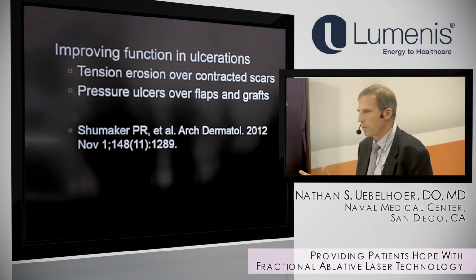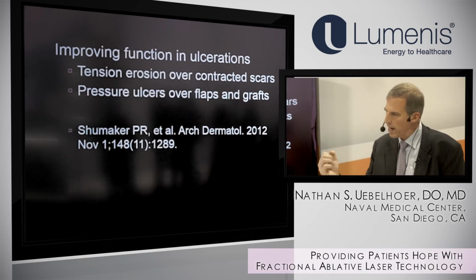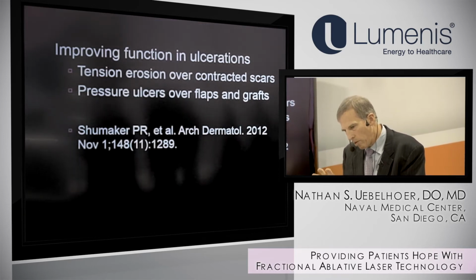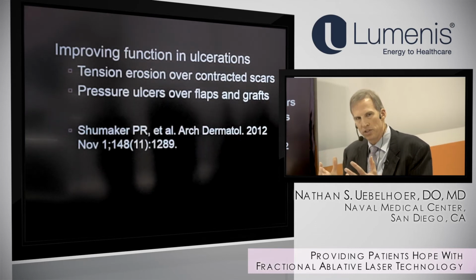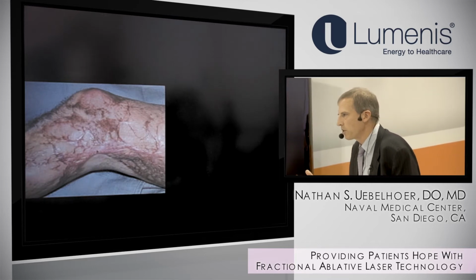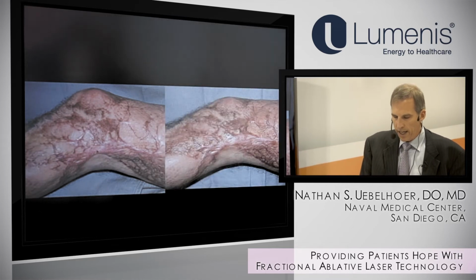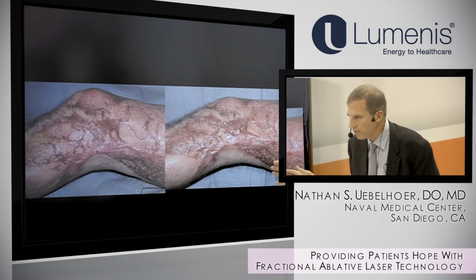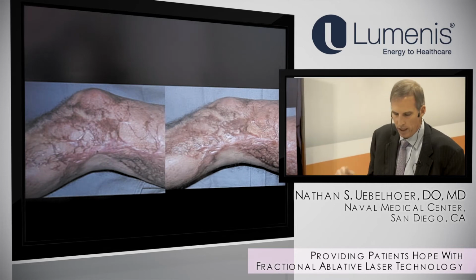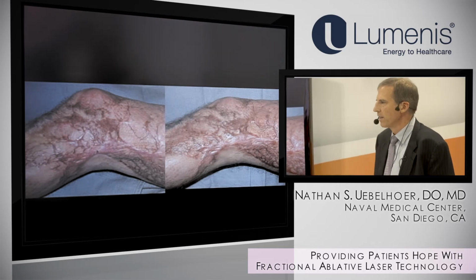The two types of ulcers that we were looking for were these tension erosions and ulcerations over contracted scars, and then the pressure ulcers over flaps and grafts, where patients had prosthetics that were keeping ulcers from healing. You'll see this is one of the early cases. This is a guy, we were just trying to improve his range of motion of his leg, and he had a little bit of an erosion there on the side of his leg as well. As we treated him, his range of motion improved. Is he perfect? No, but you can see a little bit of improvement in his range of motion. There was a dramatic improvement for him in terms of his quality of life. Plus, he said, this erosion that they'd been trying to treat for months went away as well.